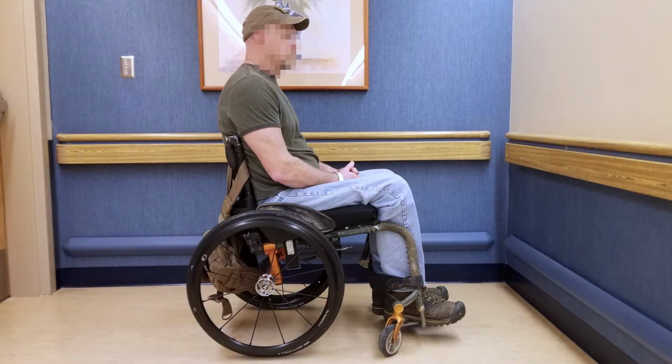Rich? So this guy, mid to low level para, has some trunk control. When you first look at his chair, you might think his axle's pretty far back. Please look at where his back is slung into the backrest. So he's actually farther back than it looks like. Why would we leave his chair alone if it looks like it's maybe too stable than it needs to be?